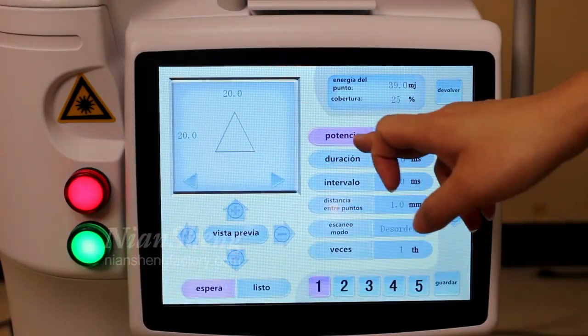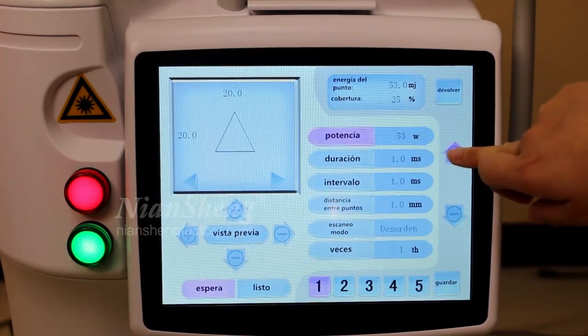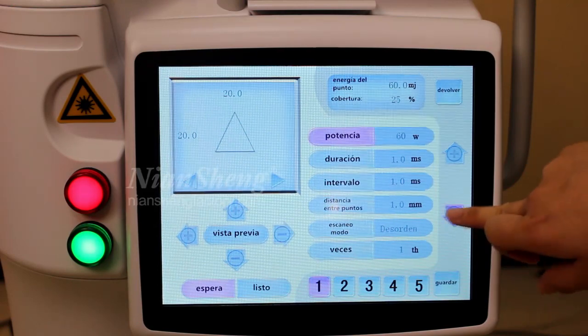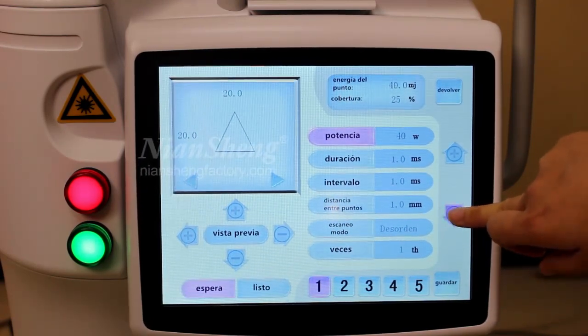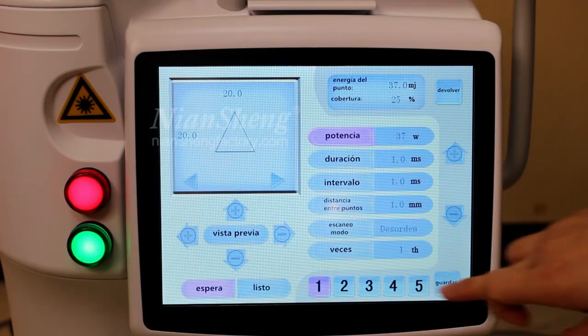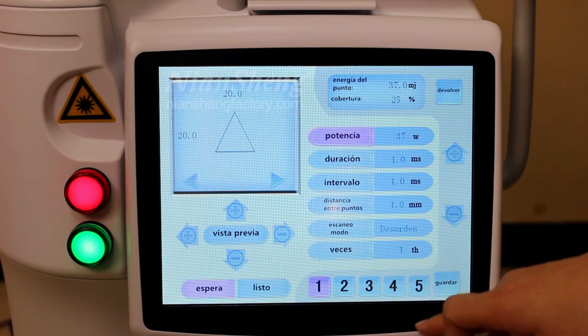This one is the power setting. The maximum is 60 watts. Now is the machine energy — we can adjust the energy according to your client's needs. And the duration, interval, and distance. Here are five modes where you can record your client's information.